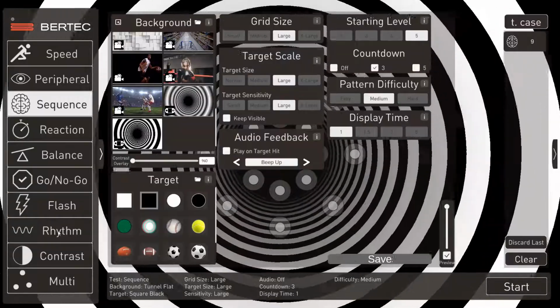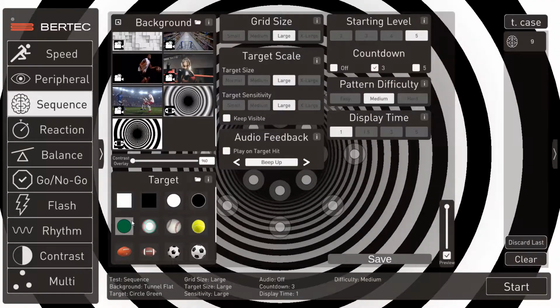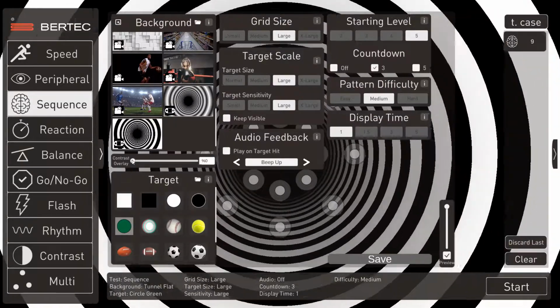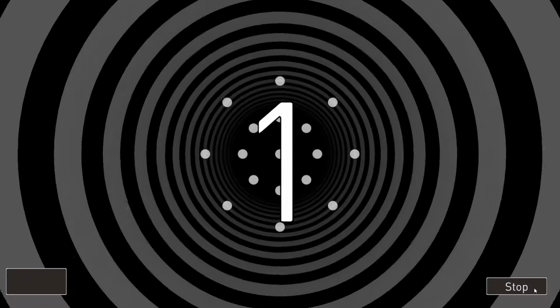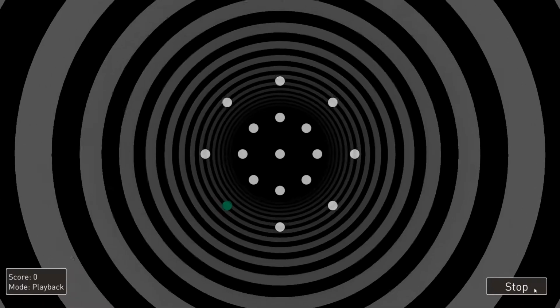But it all is for the purpose of getting them back into a real world situation. And these optic flow targets help with that. It's like walking down a hallway. Then the next logical progression would be the background with the grocery store in it, or we would add more cognitive tasks, distractions as we go along.